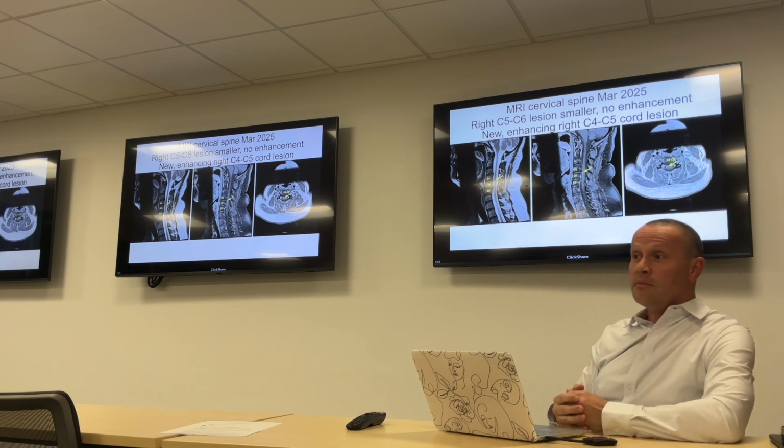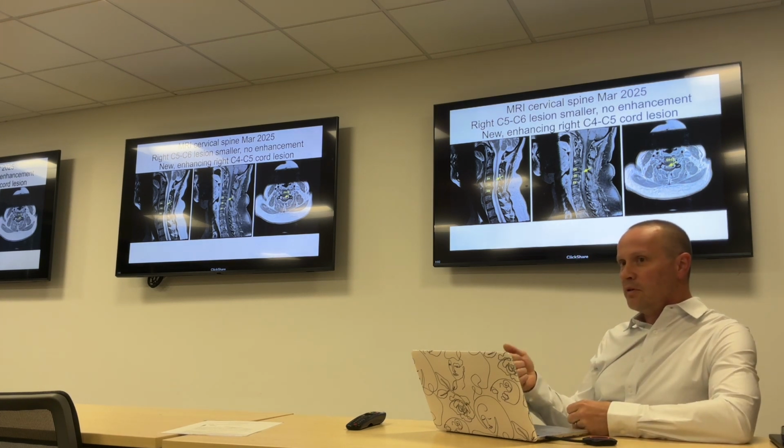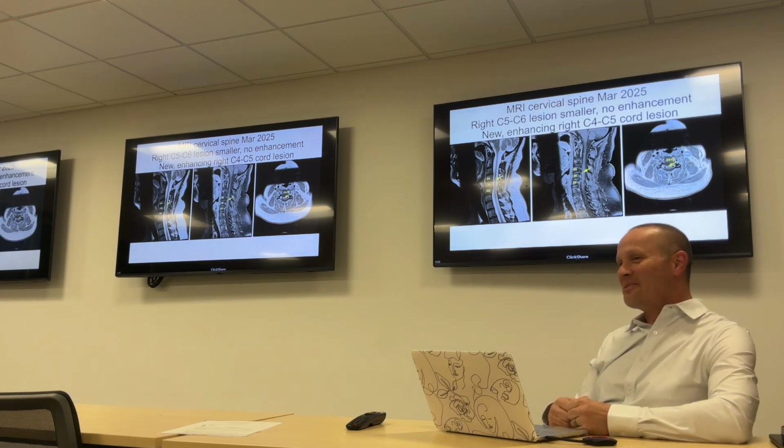And sometimes, I don't know what a case is going to show. Somebody has a headache. It could be from an aneurysm. It could be from a mass. It could be from hydrocephalus. There's a lot of different reasons to have a headache, so you have to be ready to see whatever you see. Good job. Well, we don't get them all, but we see a lot.